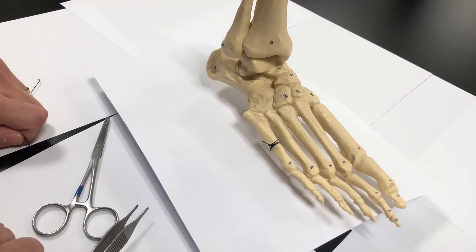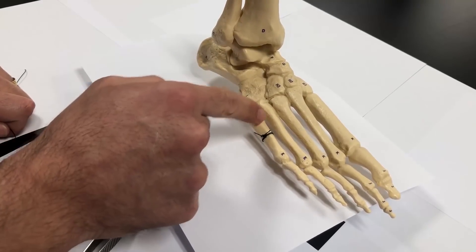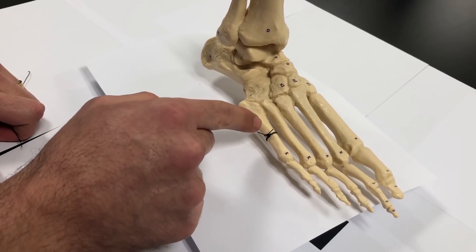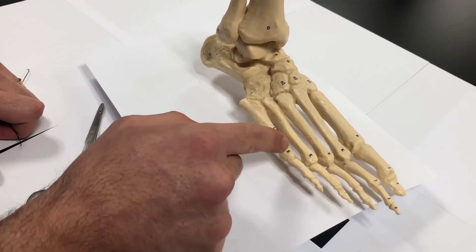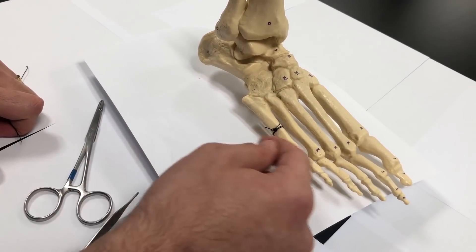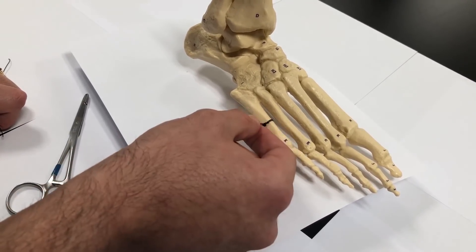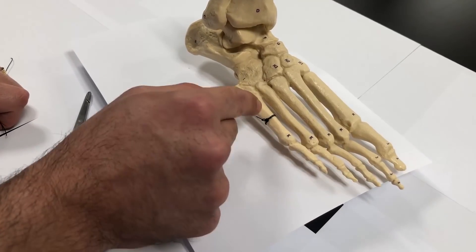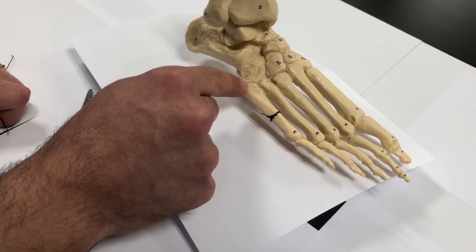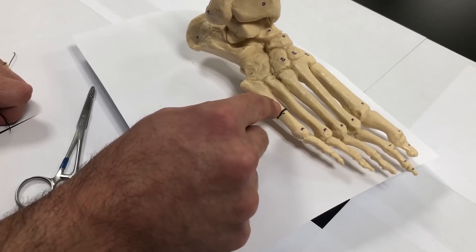And that's it. After you've done that, you can repeat. If you have a comminuted fracture, you take two broken pieces, make them into one with the cerclage technique, and move your way down so you have one big solid bone. I like to put a plate over this, which I can also reinforce with the suture cerclage technique over the bone to fixate onto the bone. If you don't have enough spots for screws, maybe you'll have a spot distal and a spot proximal, but over the middle where the comminution is, you can use this over the bone.